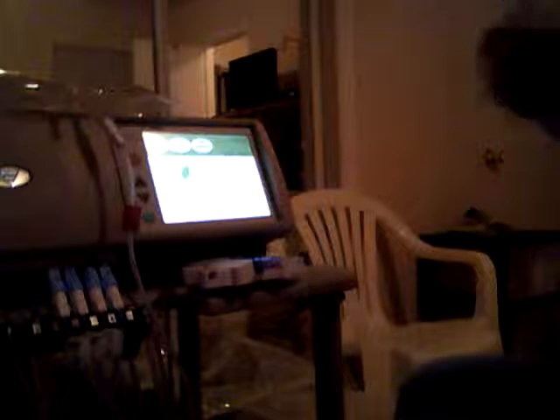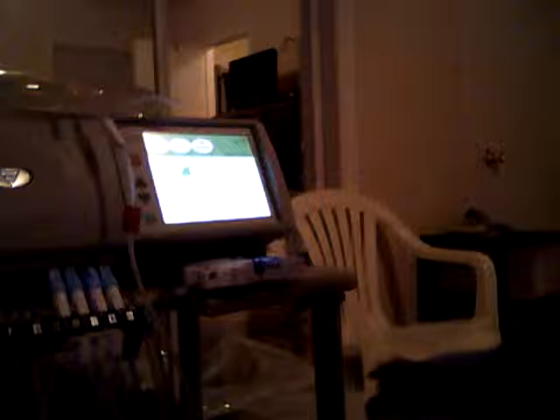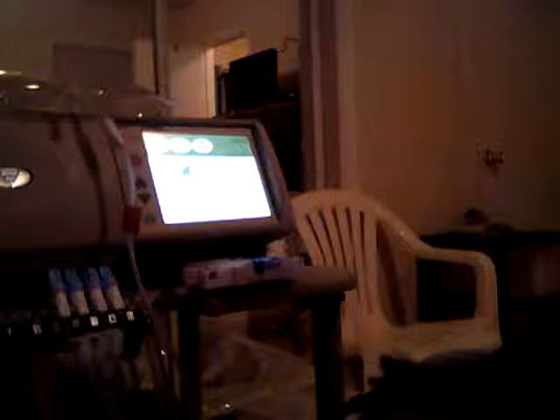And of course, now I've just picked up my computer. So, what am I going to do? I'm going to sanitize my hands again. I have enough of the sanitizer to use, so it's not like I'm wasting it. And it's almost done. I'm down to 40 seconds. The bag is almost warm completely. It doesn't take long at all for the bag to warm.